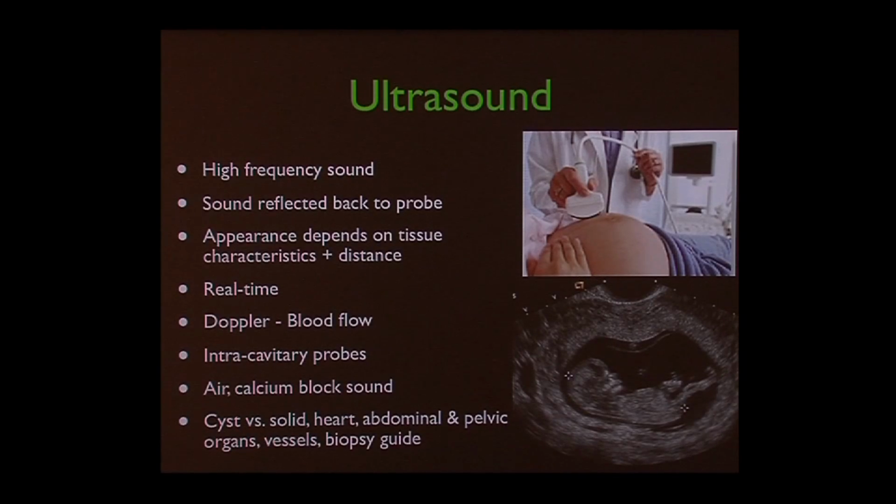You're used to thinking about it for obstetrical ultrasound, and it's very useful for looking for abnormalities or just dating the pregnancy. How big is this? It's a fairly early pregnancy where the fetus is a certain size, and we can figure out how far along the pregnancy is from that. And maybe we follow the patient later, and it hasn't grown the appropriate amount. We can say there's some growth retardation. That's not brain retardation, that's growth retardation, et cetera. So it's very useful in that regard. We can look for abnormalities of the placenta, the fluid, the baby itself, et cetera.